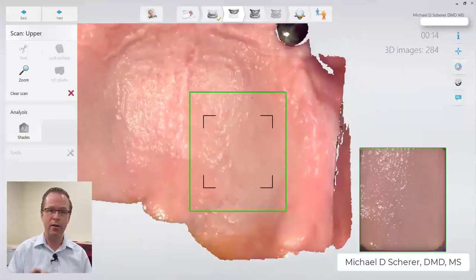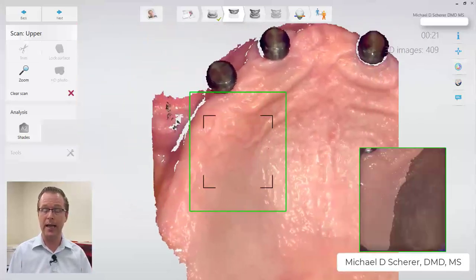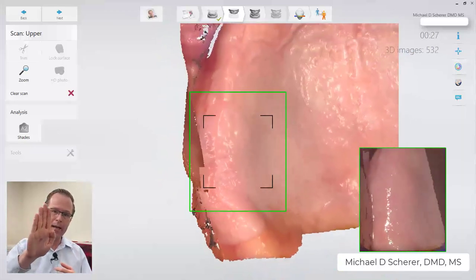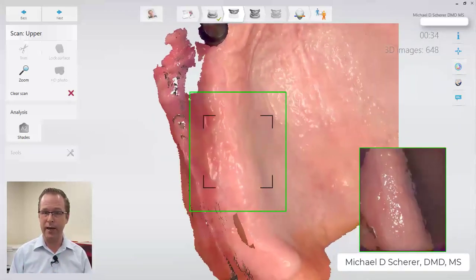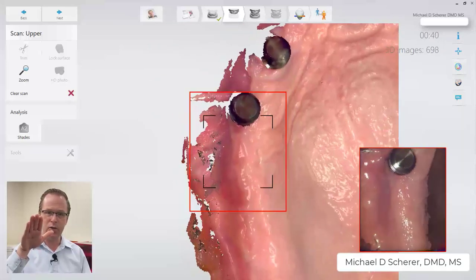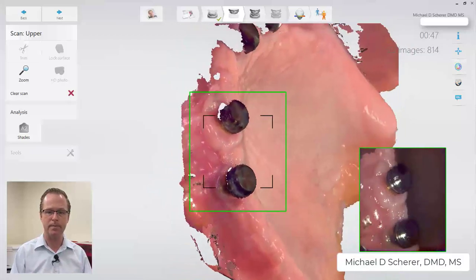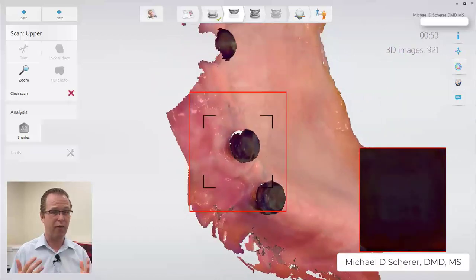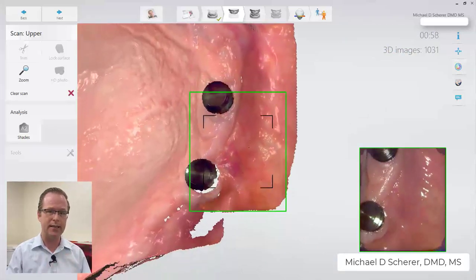Around the hard palate and soft palate we do a wax-on wax-off type motion. Once I've completed the entire maxillary arch, hard palate and ridges, I can then pull the soft tissues taut and start leaning into the back areas, making sure that I don't move the soft tissues in the vestibule while scanning. It's imperative that we keep everything fairly stable. I'm scanning fairly flat, trying not to use the scanner to push the vestibule, but capturing all of the anatomy of the locator abutment housings. I want to make sure I capture the entire vestibule all the way across before going back to dial in the details.